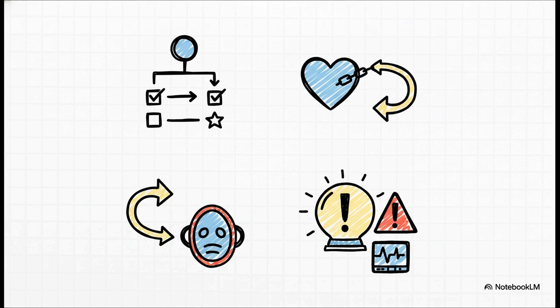And 4. Anticipate the crisis. That echo report is your crystal ball. It tells you exactly what disasters can happen to your patient. Use it to predict and prepare for every potential catastrophe before you even walk into that room.